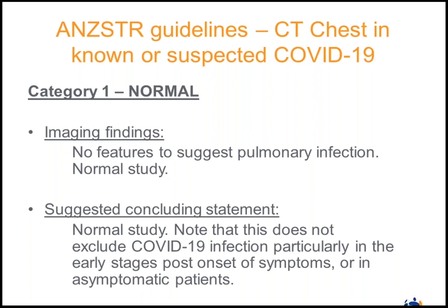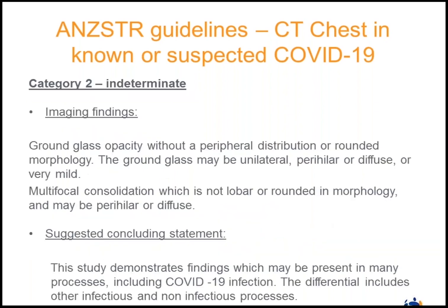So category 1, the normal category, and there's no features to suggest infection. It's normal. And to make sure you mention that this doesn't exclude an early case of COVID infection. So if you still think about it clinically, you should still correlate it with a PCR test.